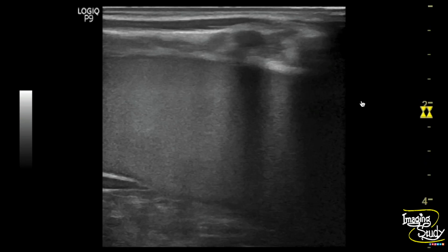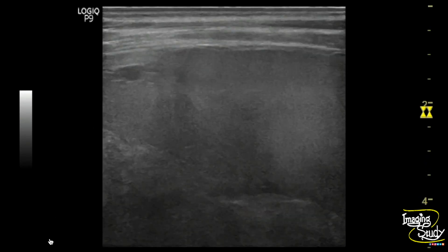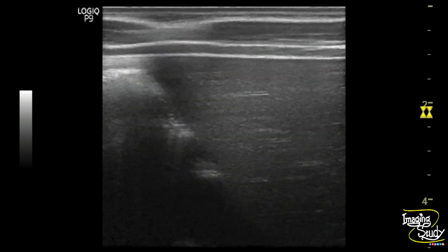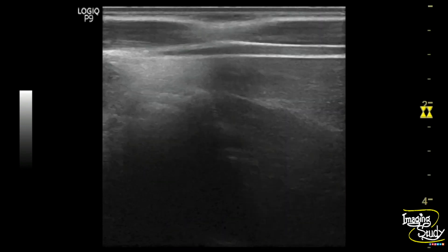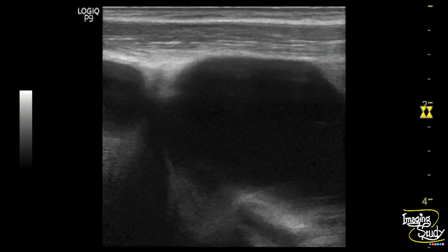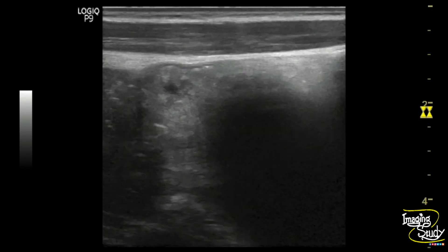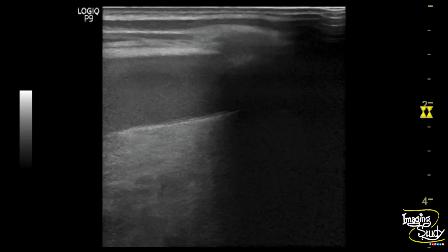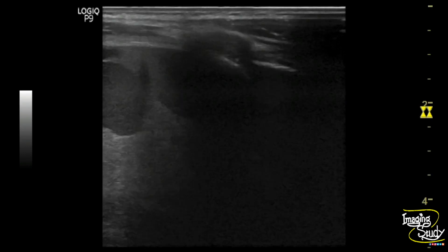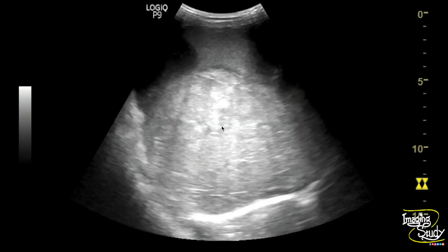Here is the linear transducer high frequency view and you can see the blood content inferior to the liver. It looks heterogeneous and you can see some hyper and hypoechoic areas as well. Here is the complex area indicating hematoma. You can see this hypoechoic area is the possible site of active bleeding.